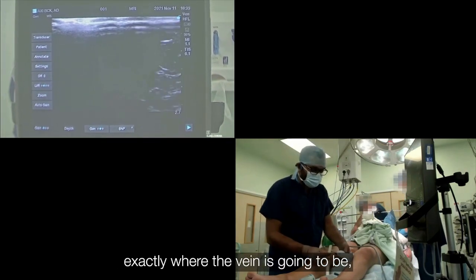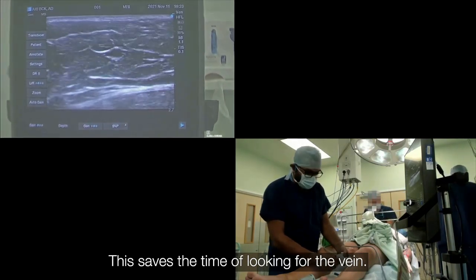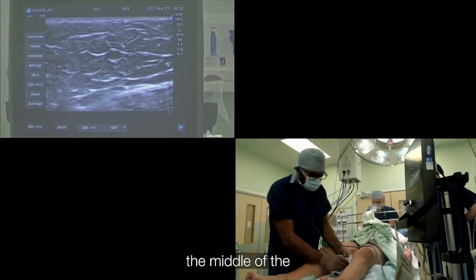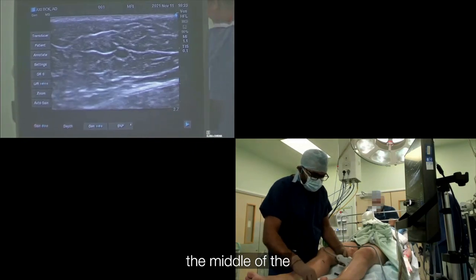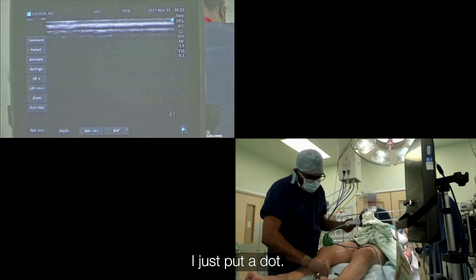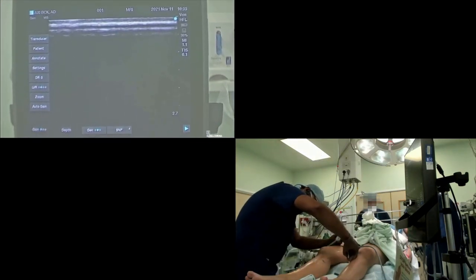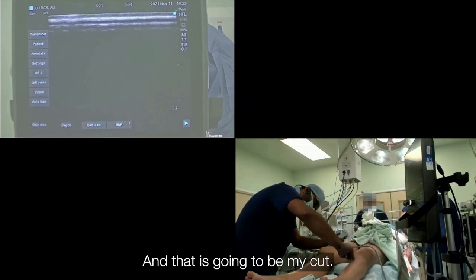I know exactly where the vein is going to be, especially on a bigger leg. This saves time looking for the vein. The vein is in the middle of the screen, so at the center of the probe I just put a dot, clean it, now I mark it. And that is going to be my cut. That's vein mapping.